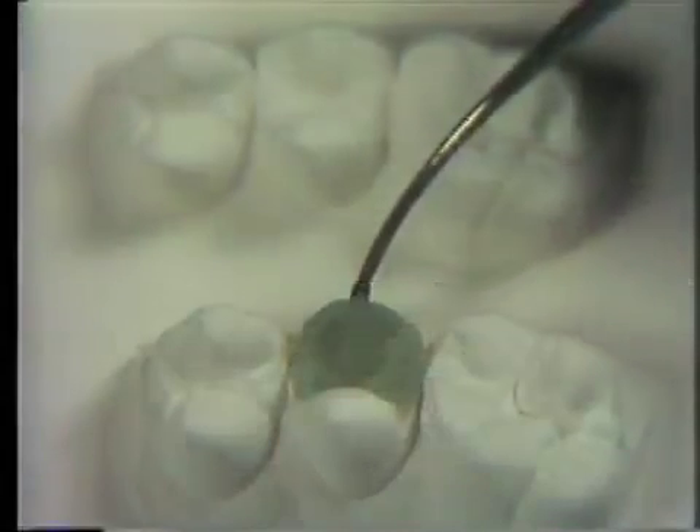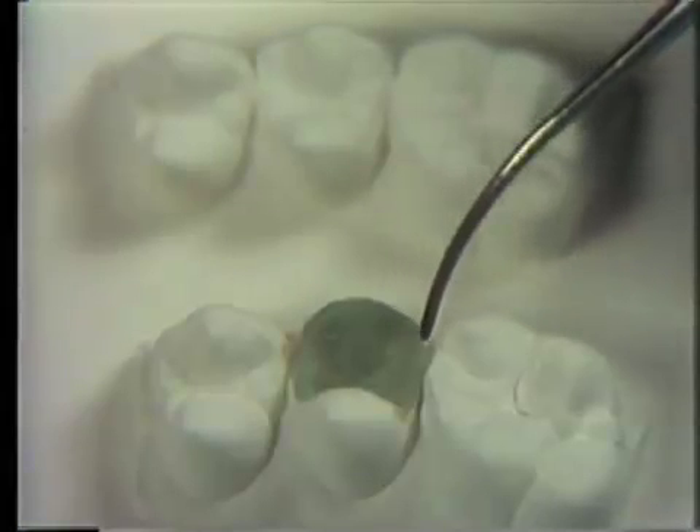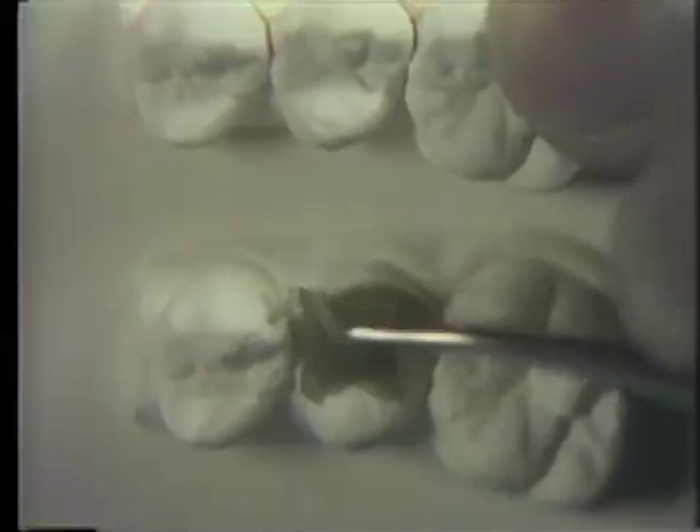Additional wax is added to improve the buccal contour and accentuate the squareness of the buccal mesial and distal surfaces. It may be useful to lift up the slab and carve with a PKT number 4. On completion of the axial contour, no wax should be left beyond the cut plaster margin.